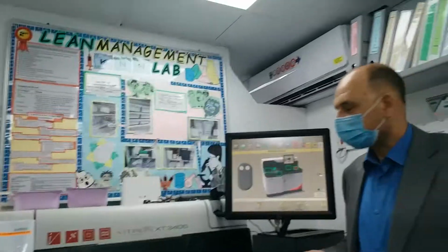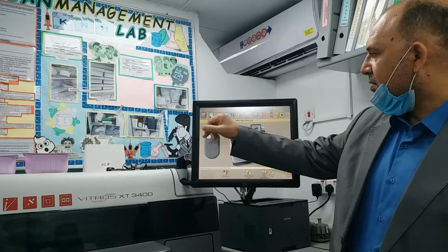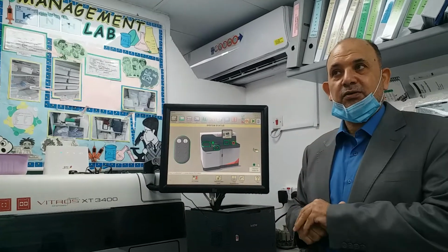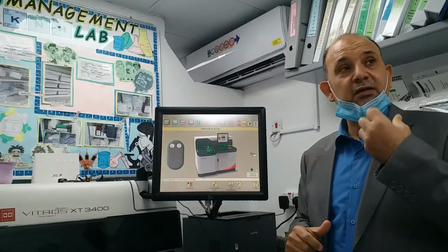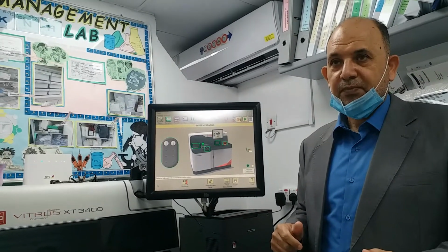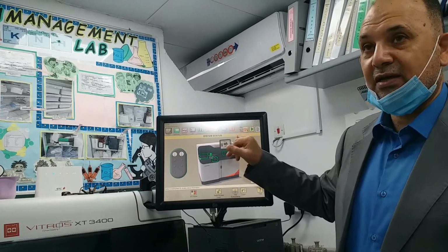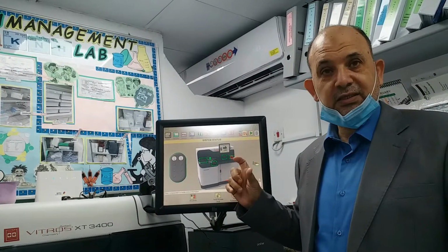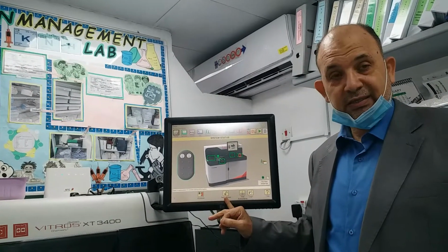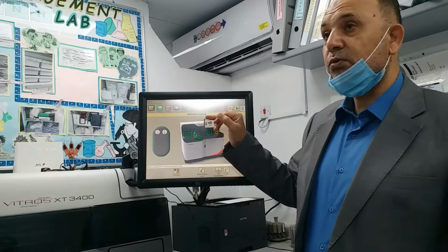Some of the icons on the system have special functions inside them, so you can request them anytime you need, but regularly you are not using them every time. For example, in case I would like to remove the key access, or the access to high level, I have to go and reset my access to the system. Then it will give you three options.